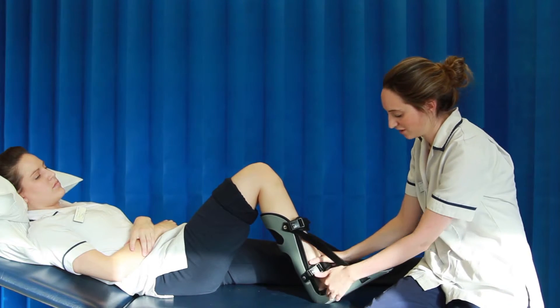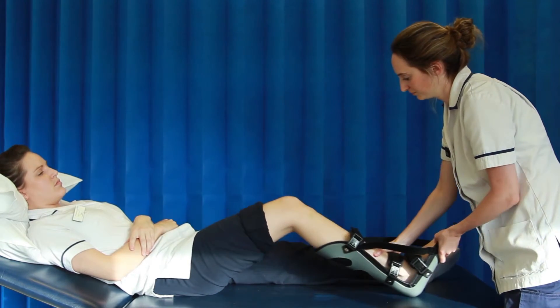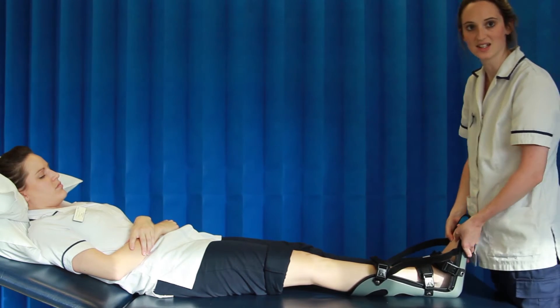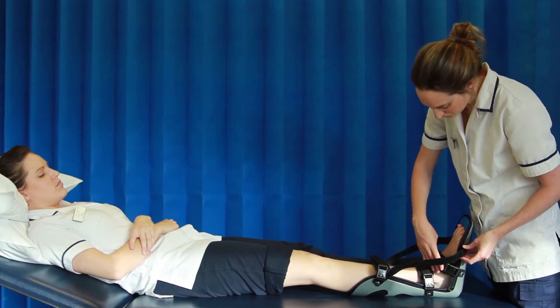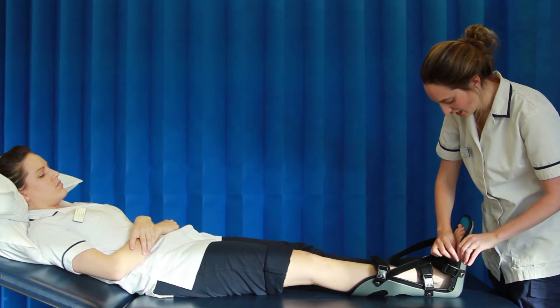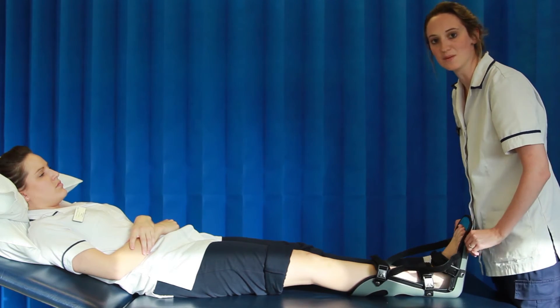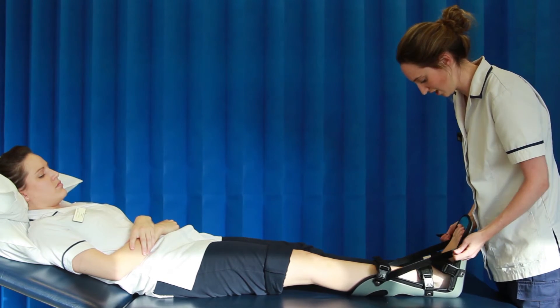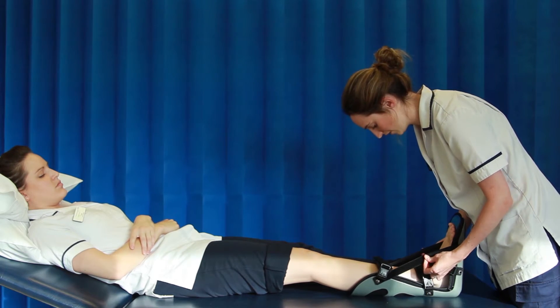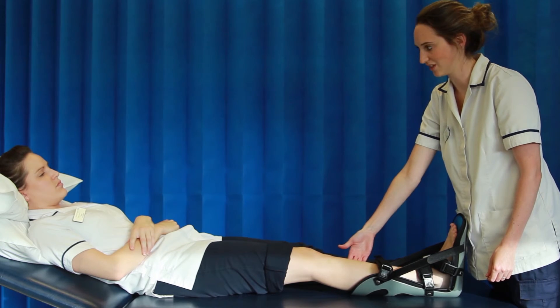Once you've achieved a good position of the ankle in the splint, the leg can then be straightened, and the straps at the sides can now be tightened, making sure that the heel is in good contact at all times. It is best to tighten the straps both at the same time, as this will enable you to get the same tension on each side. Tighten the straps and secure with the velcro. This provides a little bit of a stretch at the back of the leg.